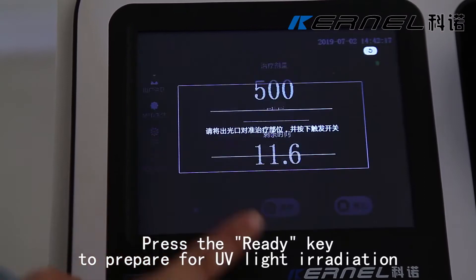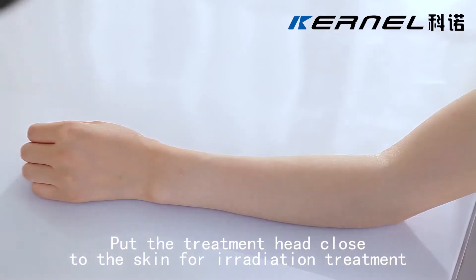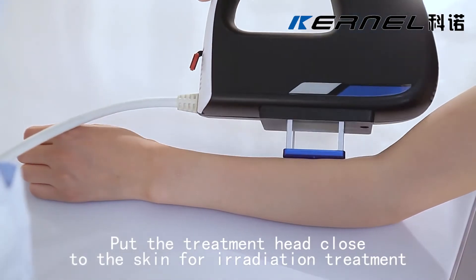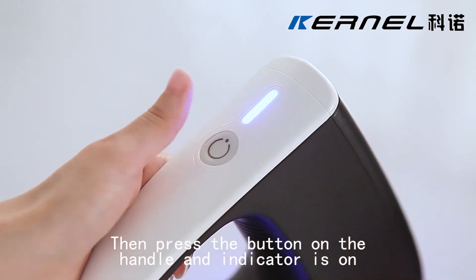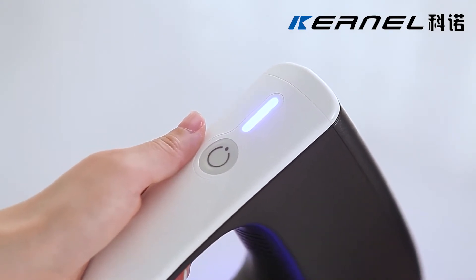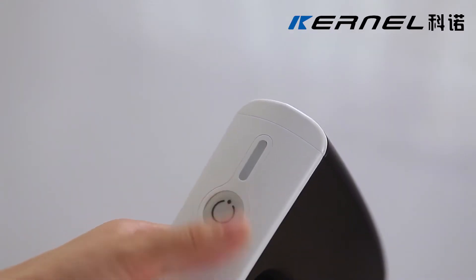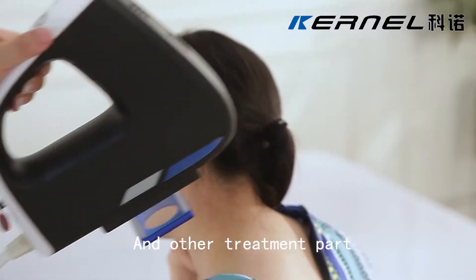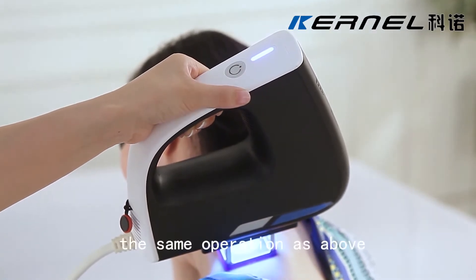Press the ready key to prepare for UV light irradiation. Put the treatment head close to the skin for irradiation treatment. Then press the button on the handle and the indicator is on. Treatment dose counts down till the end. For other treatment areas, the same operation as above.